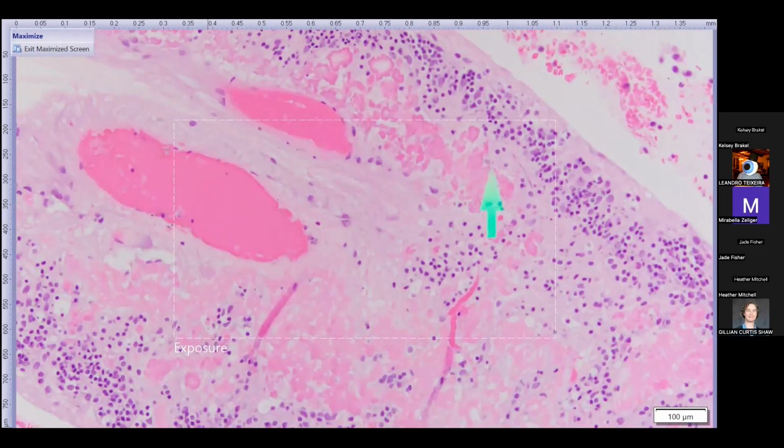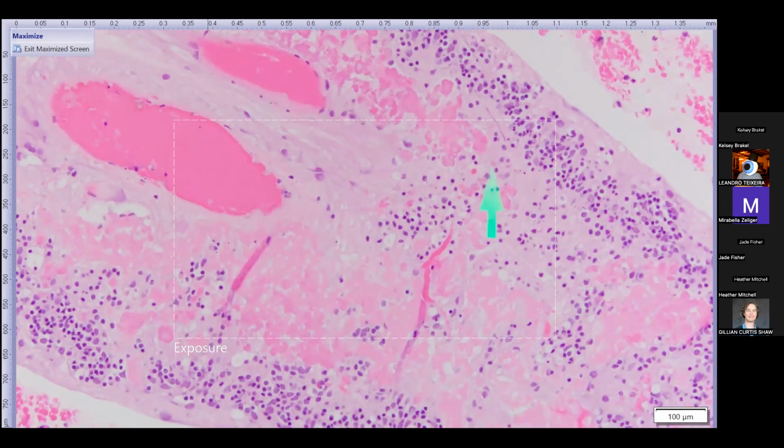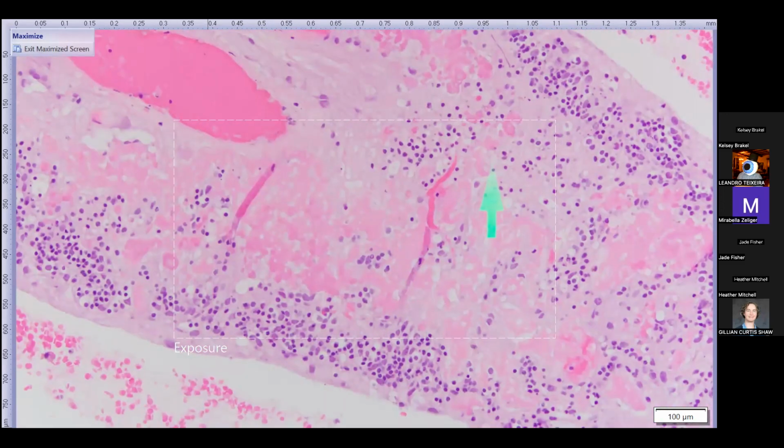You know, it's metaplasia. When we see it, it's metaplasia. That's interesting. In the retina, lens fibers. Müller cells have the capacity to undergo lenticular metaplasia. Okay. It's much more common in traumatized bird eyes. That's like the classic place to see it. It's much more rare in mammals. We do have a couple documented cases, but usually there's something going on that's a very different pathological picture than what we have here.